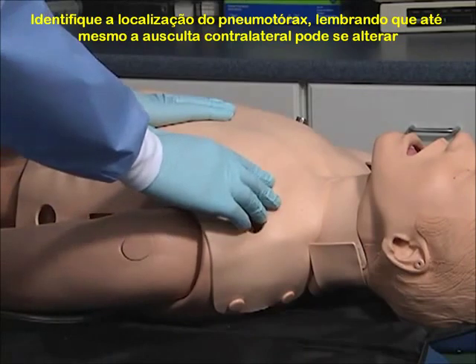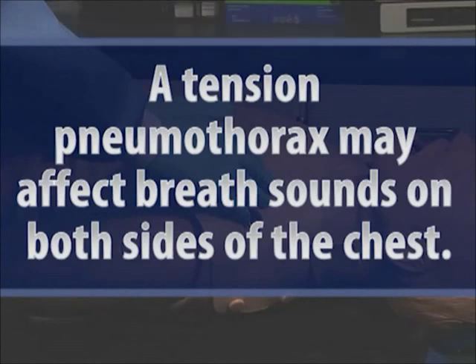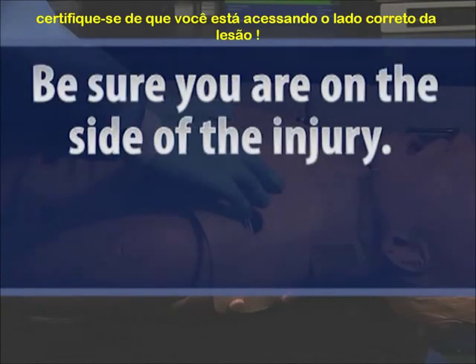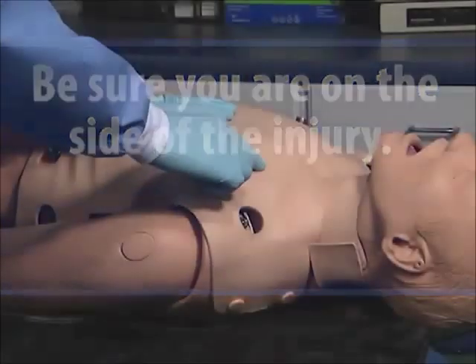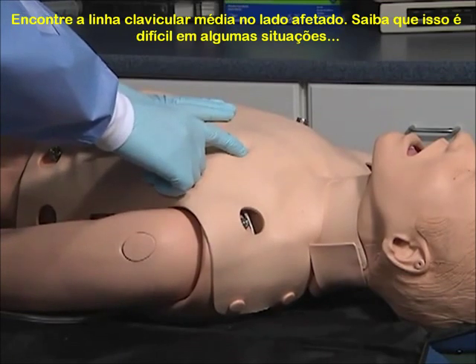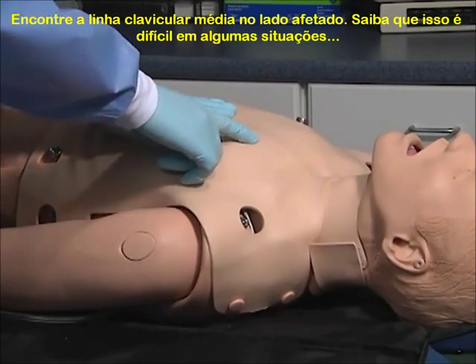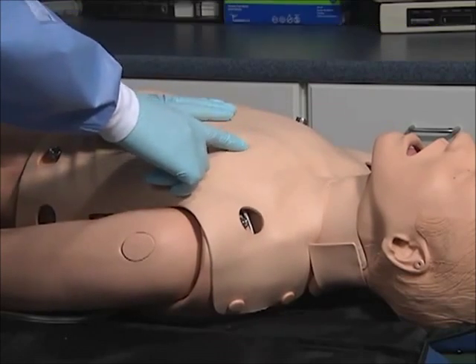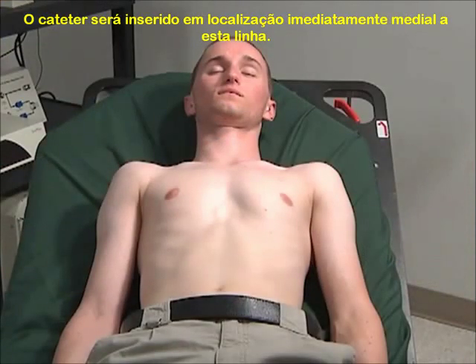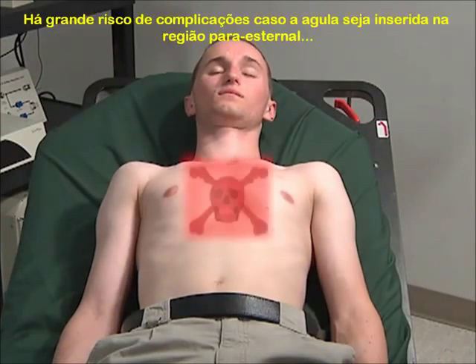Identify the location for needle insertion. Remember, a tension pneumothorax may affect breath sounds on both sides of the chest, so be sure you are on the side of the injury. Find the mid-clavicular line on the affected side. Studies have shown that a significant number of healthcare professionals have difficulty locating the mid-clavicular line and actually insert the catheter medial to the ideal location.